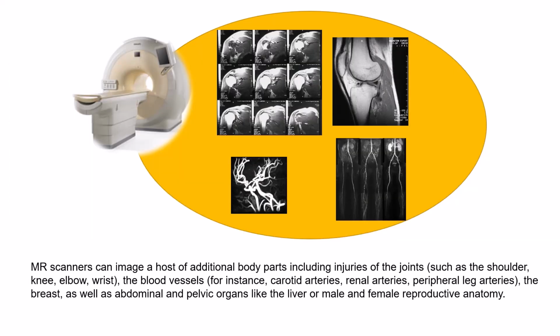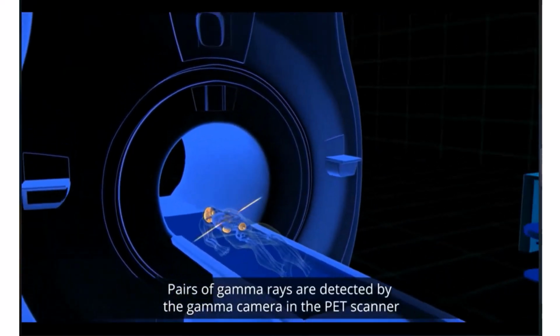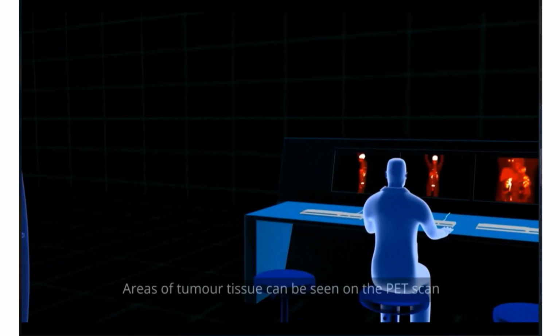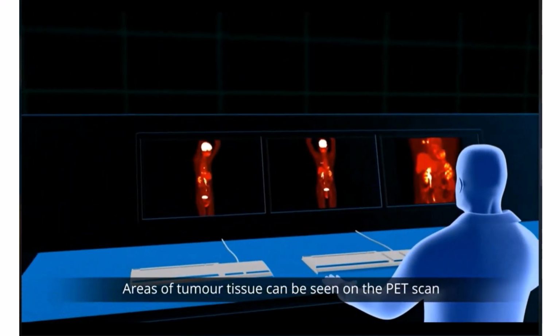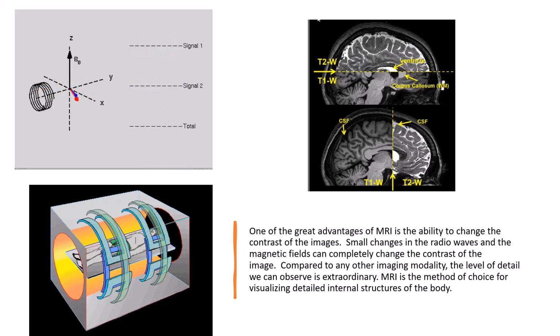We also have hybrid scanners combining positron emission tomography, which is nuclear medicine, with MRI. And the nuclear medicine, or PET, shows us the physiology of the body. MRI is phenomenal at showing detail and tissue.